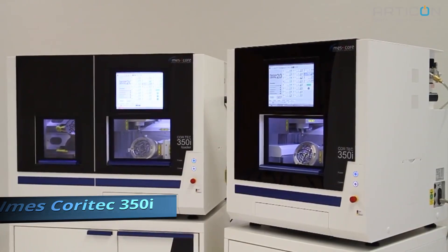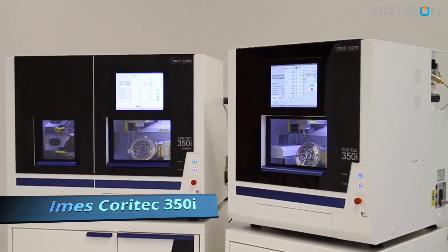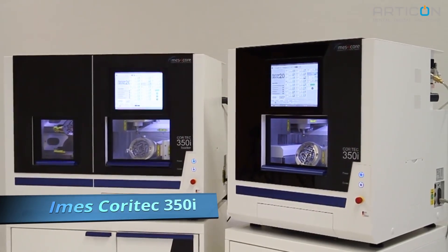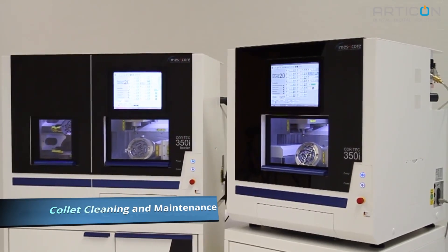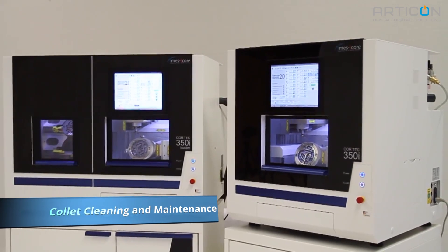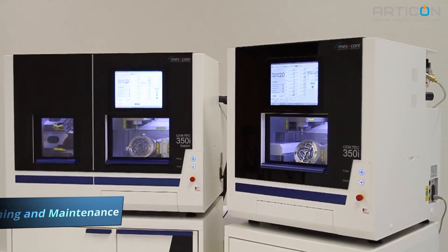Hello everyone! In this video we are going to show you how to clean and maintain the collet chuck on IMS iCore 350i milling machine.